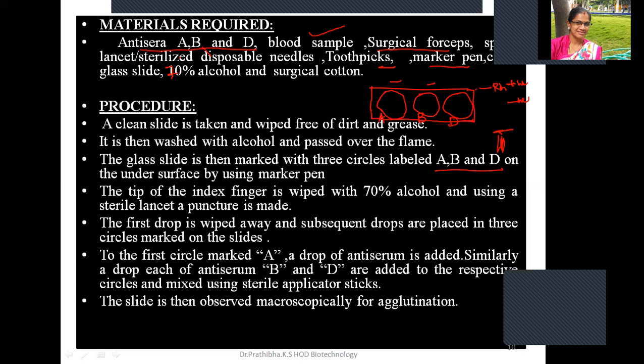So next, what will happen after the marking? Why do you need to mark the under surface of the slide? Because when you put the blood and when you put the sera, what happens?